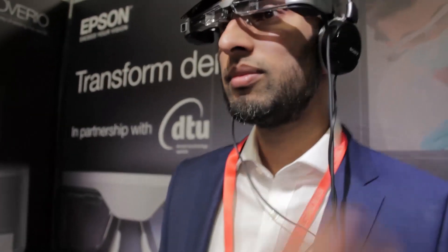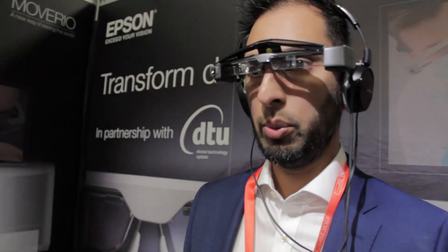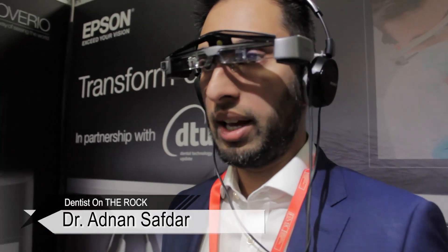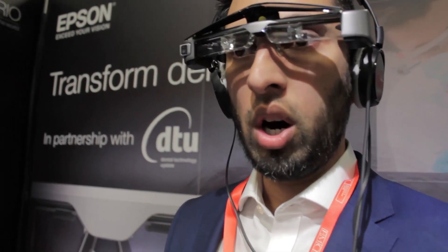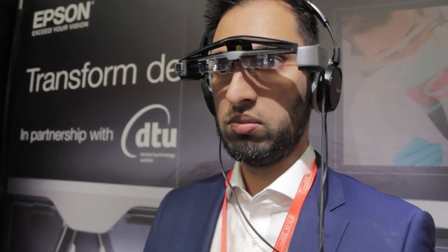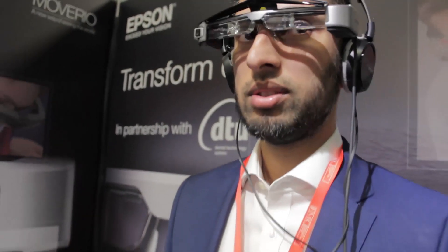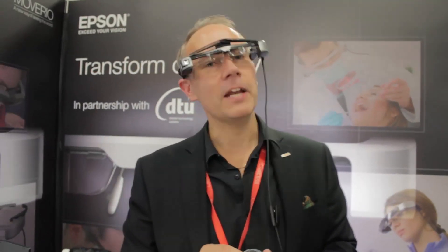And the scanner as well — it looks like it would actually make life far easier. You could scan the patient whilst looking directly into the image rather than having to constantly turn your back to look at the monitor. You can just look straight ahead. It looks very good. I'm really, really impressed by this.